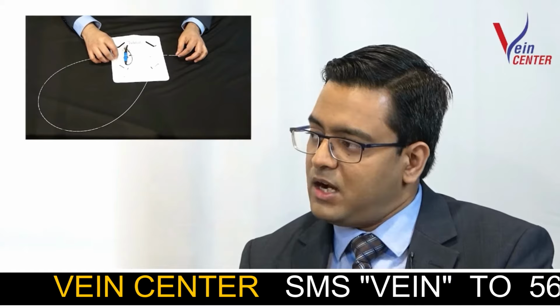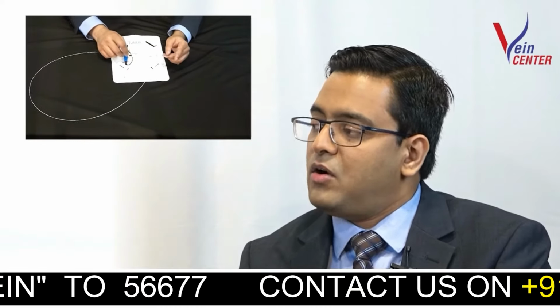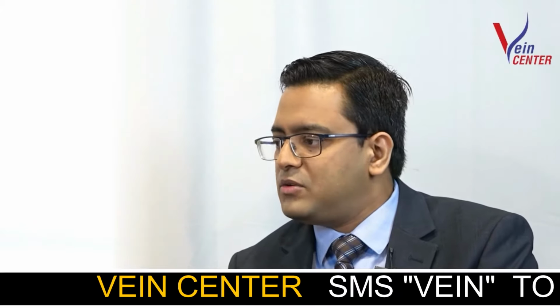In addition to that, we had to inject a lot of fluid around the veins so that we protect the surrounding tissues, so the nerves, the muscles and the skin don't get burned. So this was minimally invasive, but it required a longer recovery, and it was a procedure in which anesthesia was required. The thermal ablation procedures, radiofrequency or laser, do require the patient to wear stockings compulsorily. These are heavily dependent on stockings. But again, these were probably until the early 2000s, 2015, 2017-ish.